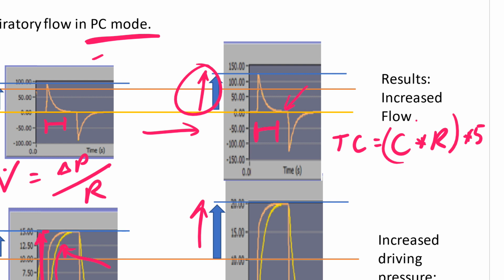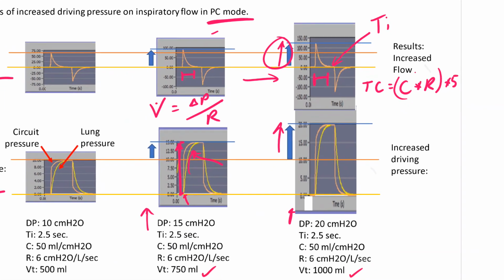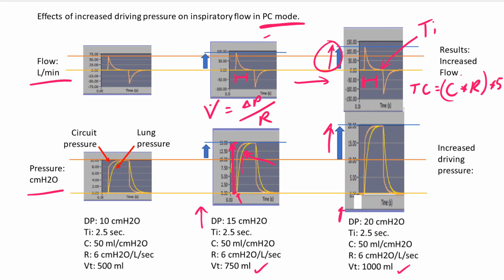Then we have our little bit of an inspiratory plateau here because we've established that with our TI control on our ventilator. So the highlight of this particular slide is what I wanted you to realize: when we increase driving pressures, we increase peak inspiratory flows. So by limiting our driving pressure, when we keep our driving pressures quite minimal, we minimize our peak inspiratory flow.